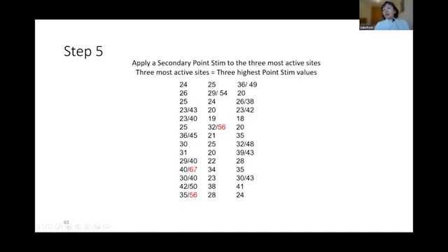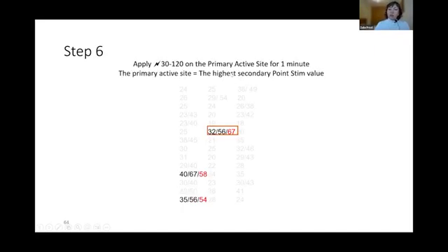And already I can see the pattern. This person has sciatica pain, yeah, because this is mid-thoracic and this is coming to the hip area. So 56, 67, 56, 3 highest readings out of all. So we choose these 3 highest readings. And we treat them again, and we treat with point stim.